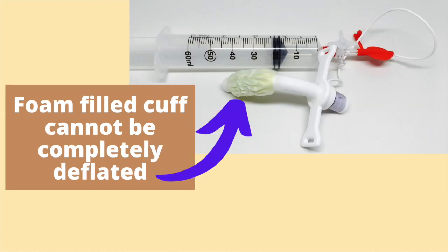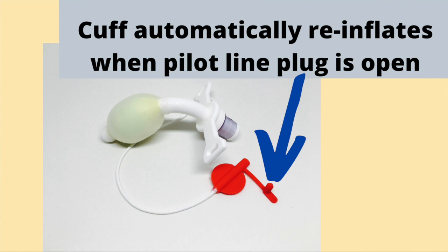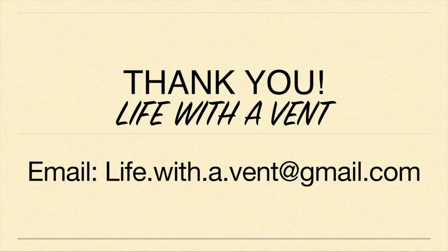A foam-filled cuff cannot be completely deflated. Foam-filled cuffs must not be used with speaking valves or for capping use. Additionally, there is a risk for spontaneous reinflation with a foam-filled cuff. Foam-filled cuffs are not frequently used; they are typically utilized in patients with known tracheal wall damage due to a tracheostomy tube cuff.